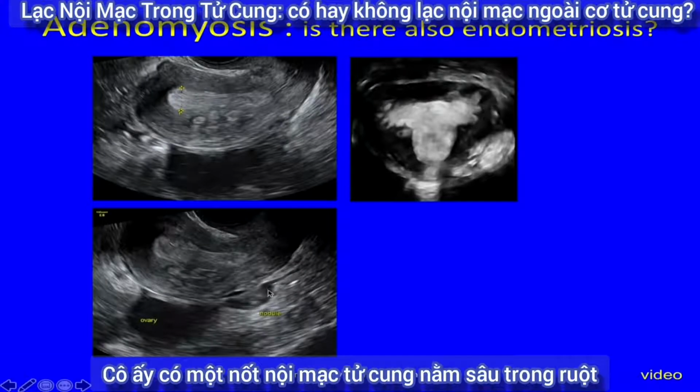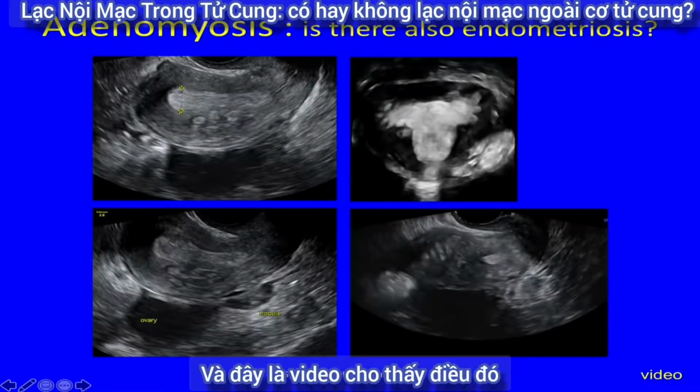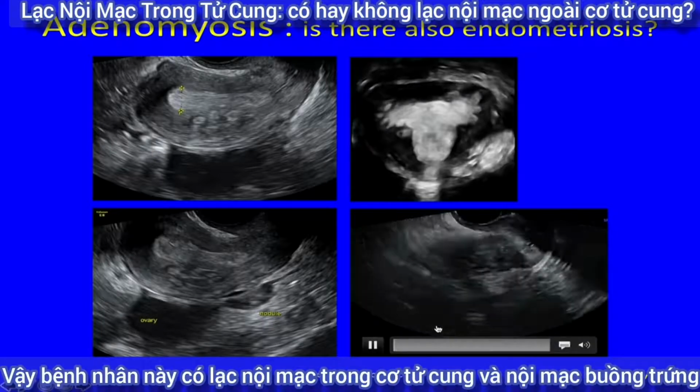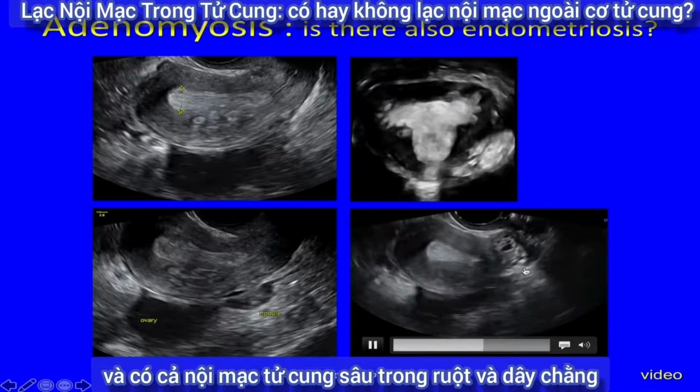She has a nodule of deep endometriosis in the bowel, and she's also got deep endometriosis in the ligaments here. And this is the video clip just showing that. So adenomyosis in the myometrium, an ovarian endometrioma, and then deep endometriosis in the bowel and in the ligaments.